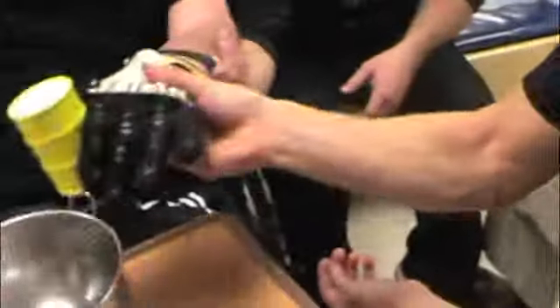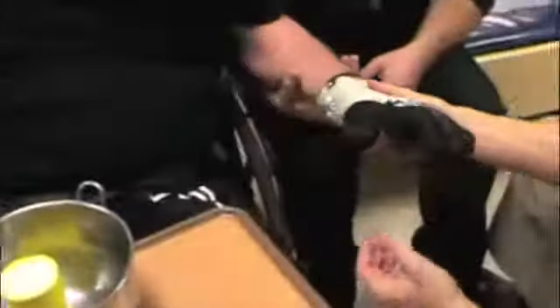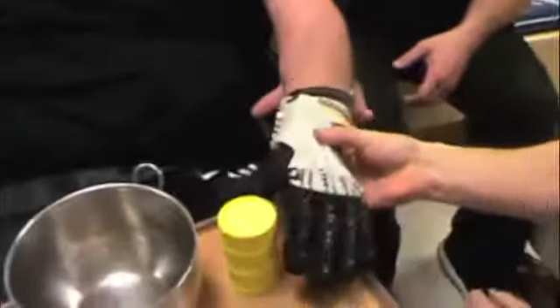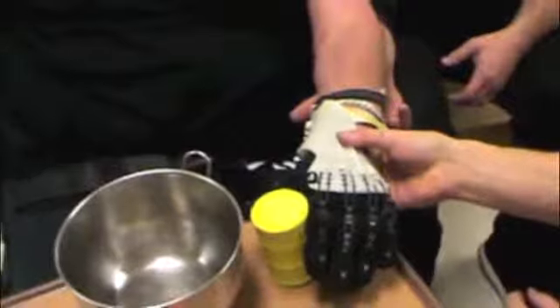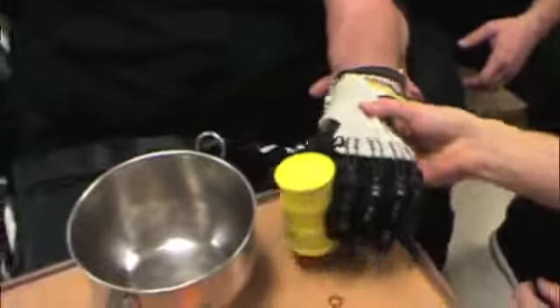By positioning his hand functionally with the SABO Glove, he is now able to perform grasp and release test training which is essential for neuroplasticity and motor relearning. Hand function would not be possible without this assistance.